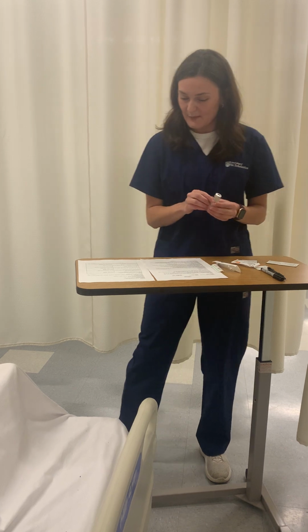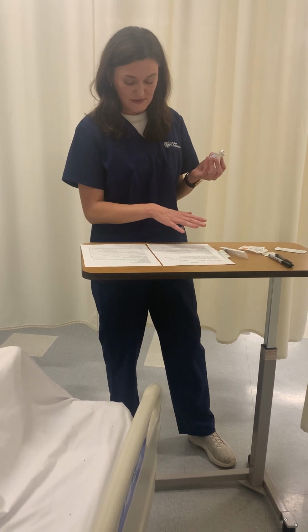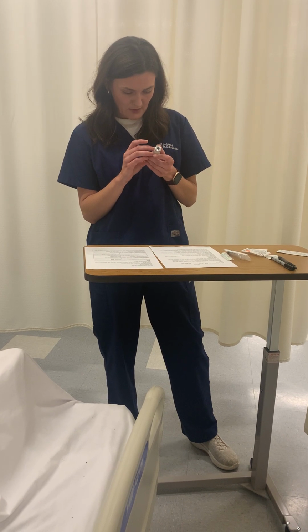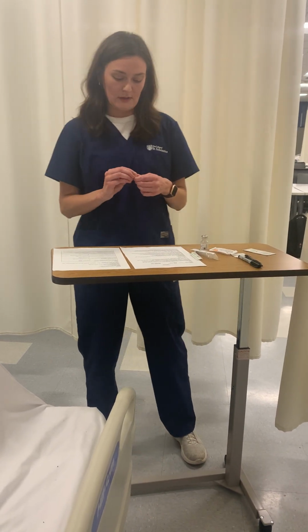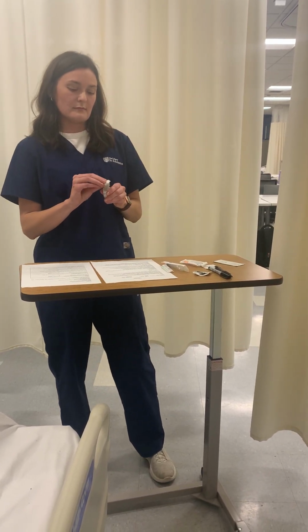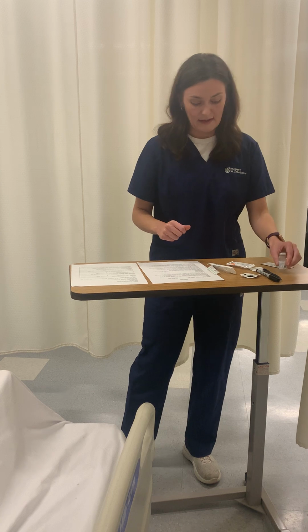So I'm going to do my second med check here, and we're doing the Fluzone. Fluzone, influenza vaccine. Okay, we're going to do 0.5 mL, syringe matches. The time is now, the route IM. Okay, and the reason is to prevent complications of influenza. So I'm going to clean my vial for 15 seconds. Okay, we'll say 15 seconds has gone by. We're going to let that completely dry.